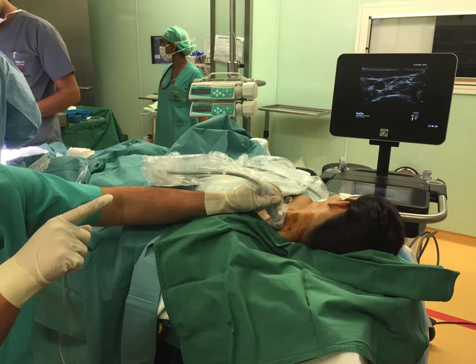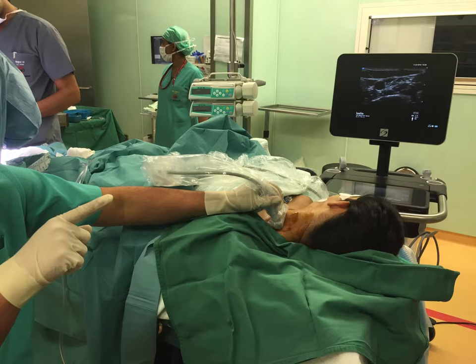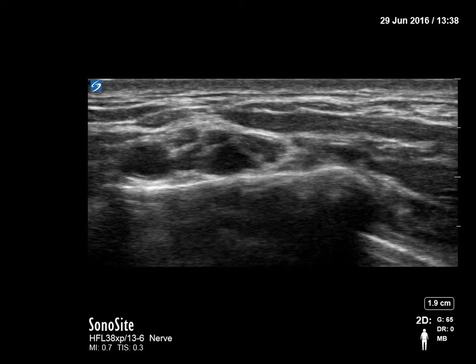This is how you scan your supraclavicular brachial plexus. Ideally the head should be a little more elevated — 35 to 45 degrees gives a better picture. You start from the carotid and come laterally, and you start seeing the subclavian artery. Once the subclavian artery is visualized, most of the time you see the supraclavicular brachial plexus. This is one of those scans of the supraclavicular — it is a video scan.